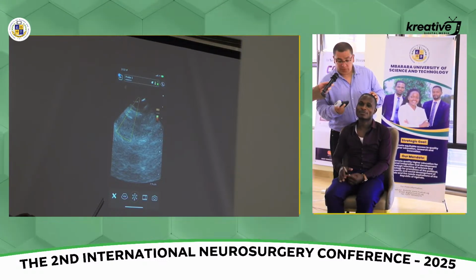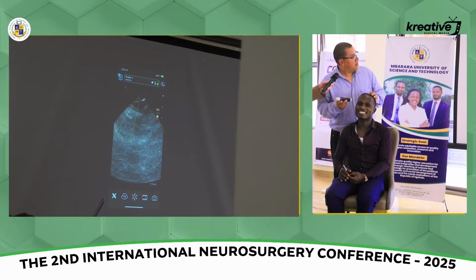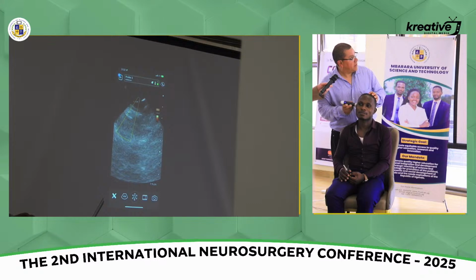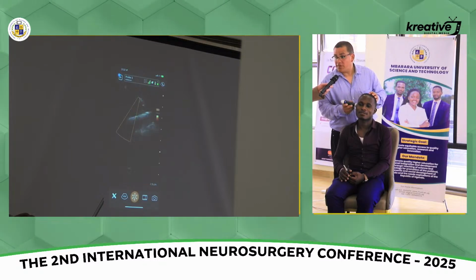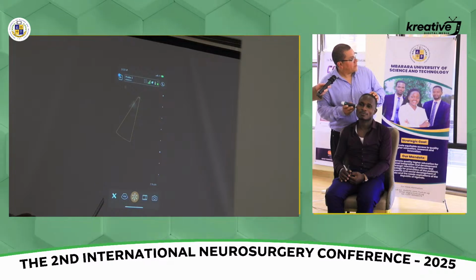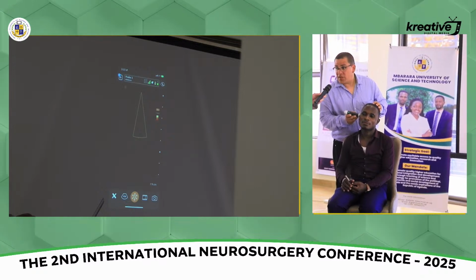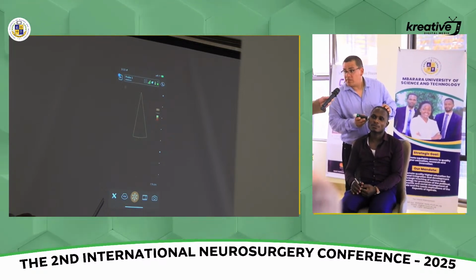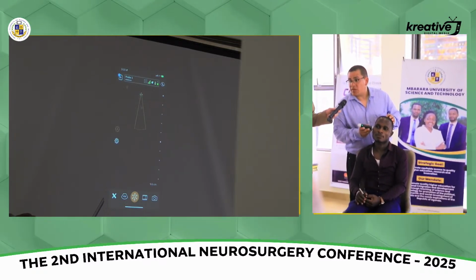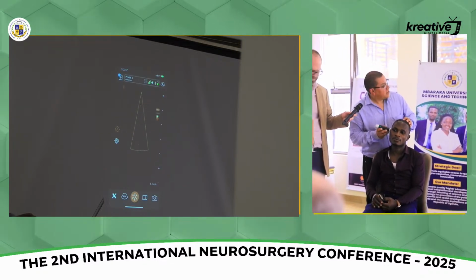Do I freeze it? It's not live, right? Ready? Okay. So, can you move that to the middle? The box to the middle. There you go. And what is the depth? All right, let's go down to 6 on the depth. Right there. Thank you.